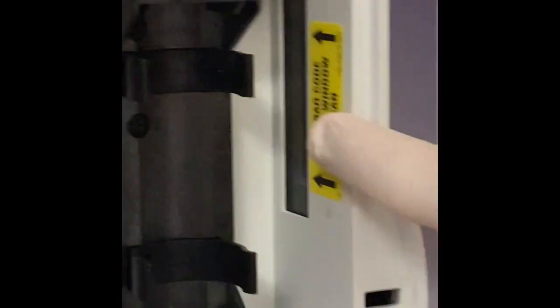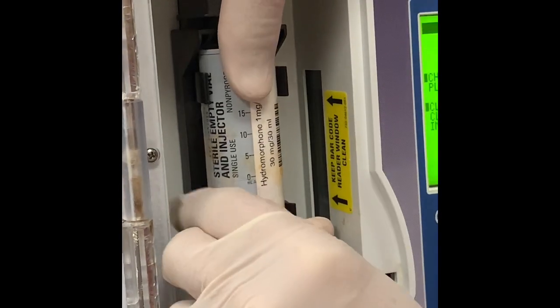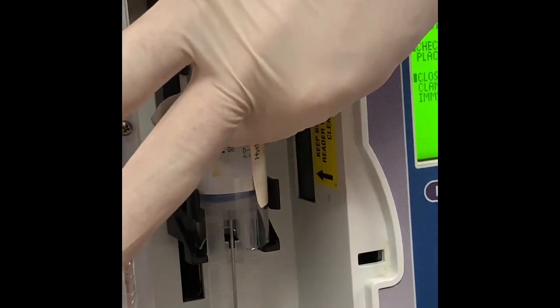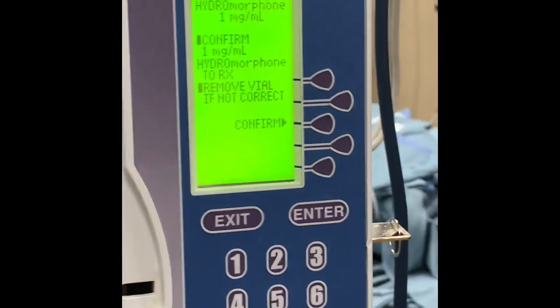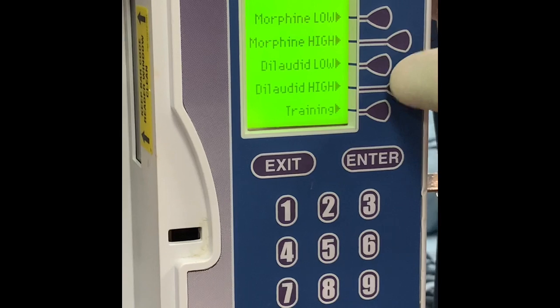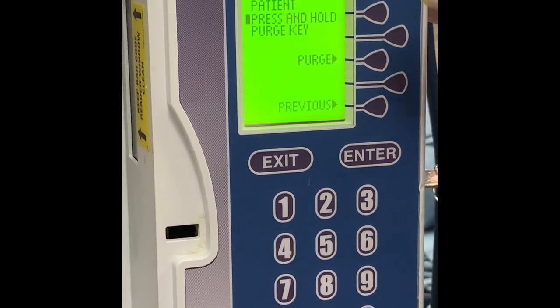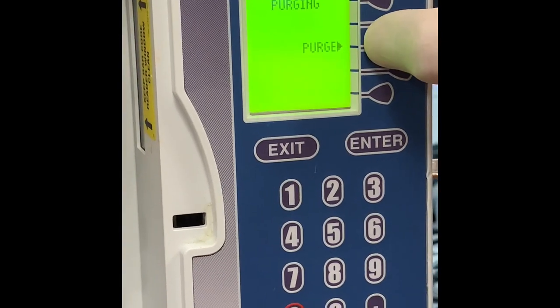Your syringe has a barcode on it. Line that up with the barcode scanner inside the pump, snap it into place, and adjust as needed so the reader can scan that barcode. Once it's in place, push down until it clicks the base of the plunger into the clamp at the bottom of the pump opening. The barcode will read the medication, then you'll verify which medication it is, and it's going to ask you if you want to purge — yes, we want to purge.